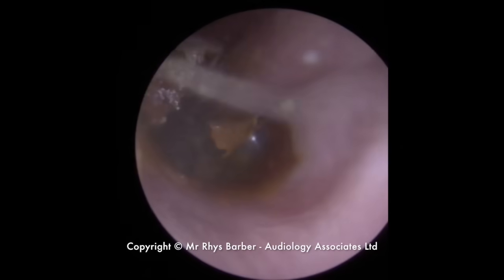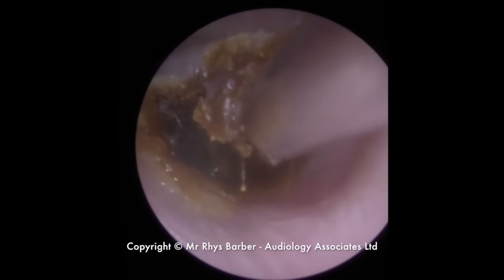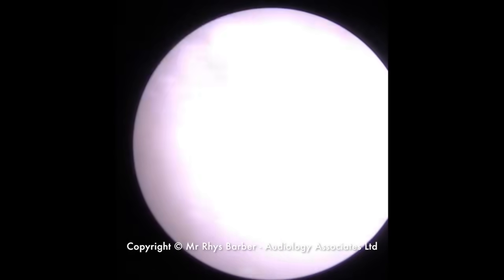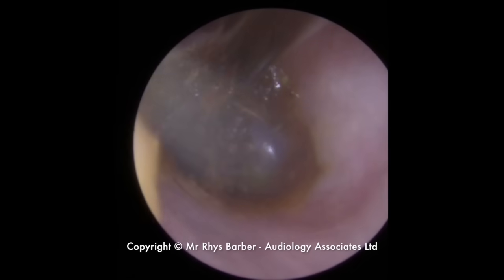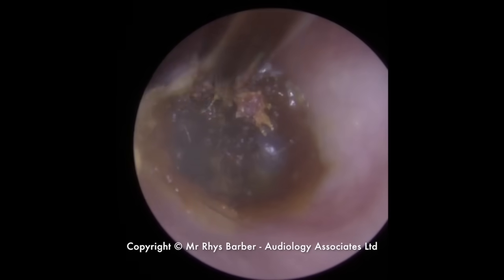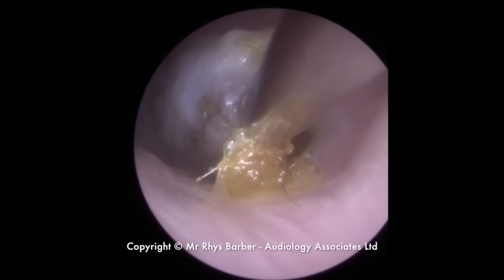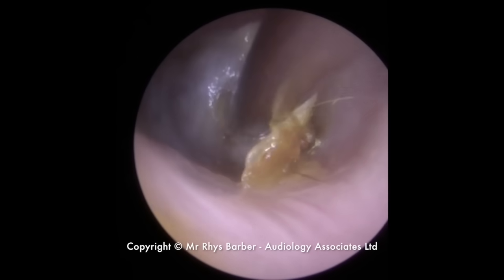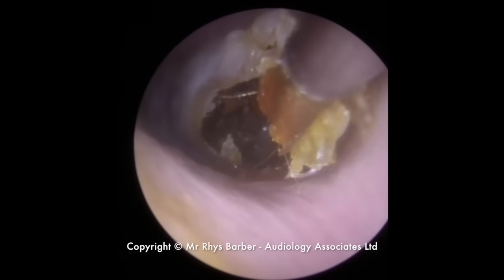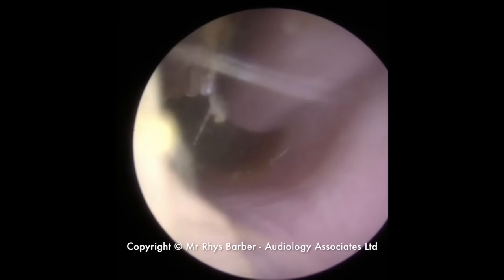I know you guys have seen me use crocodile forceps to go in and remove this. The difficulty here is the crocodile forceps wouldn't fit. The ear canal itself would accommodate it, but I couldn't accommodate that and the endoscope at the same time. So we're having to just very slowly work our way along this, trying to get a grip on the skin. But when you're putting the suction in, obviously the skin gets pulled into the suction, so sometimes as you're trying to move it out of the way, the suction pulls it back into place. Just breaking little pieces away.